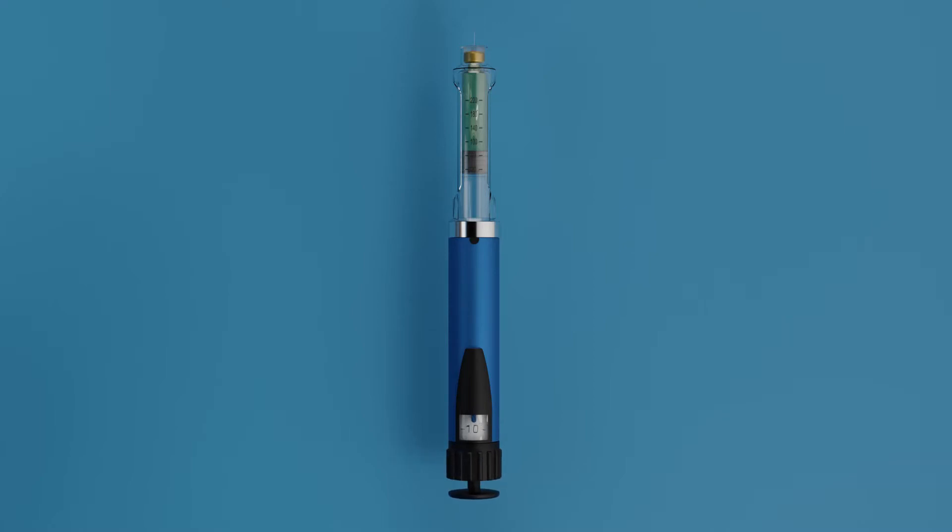Dial and press till the plunger touches the grey rubber stopper of the cartridge. Tap the cartridge holder gently to raise any air bubbles to the top of the cartridge. If there are no air bubbles to be seen, then the pen is ready for use.